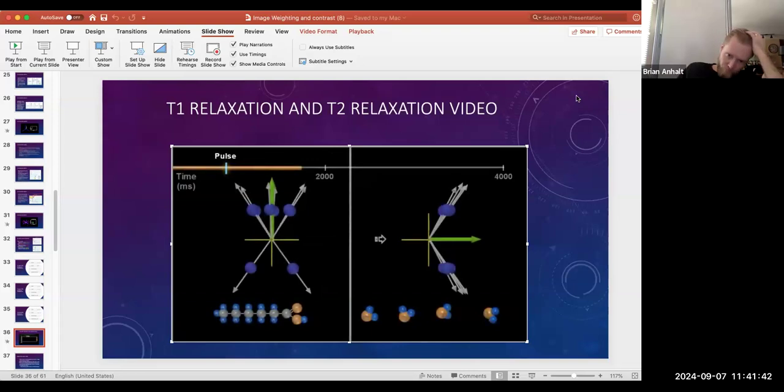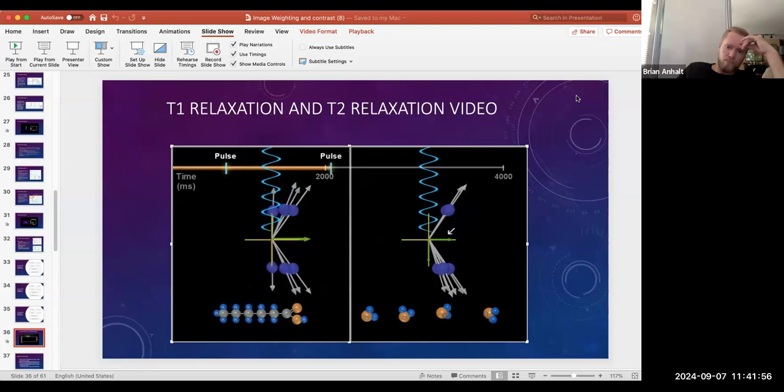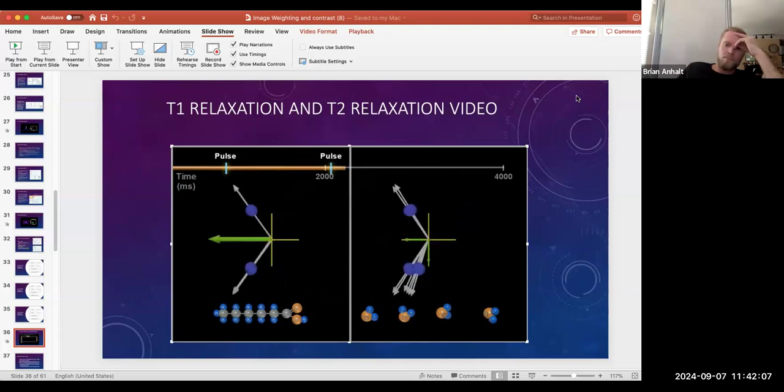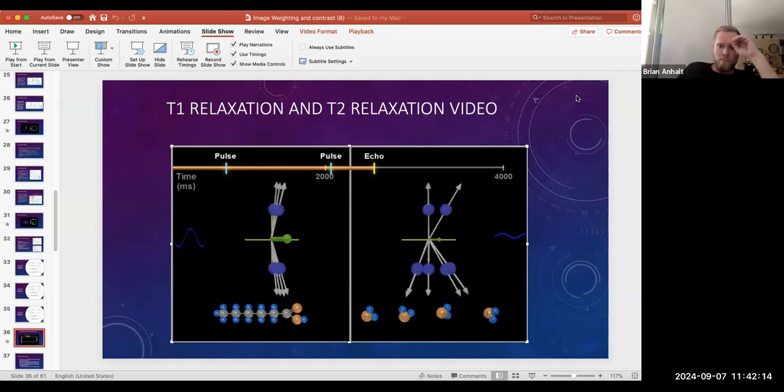However, the water protons are still in a high energy state with little regrowth of the longitudinal magnetization. Therefore, the new radio frequency pulse flips more of the low energy protons into the high energy state and can only produce a small transverse magnetization as well as a net longitudinal magnetization oriented 180 degrees, or directly opposite the main magnetic field. This configuration in the water protons will give a low amplitude or low energy wave when we listen for the echo or return signal.